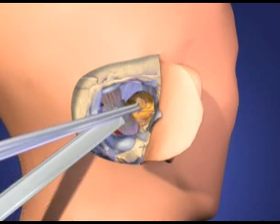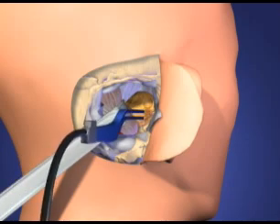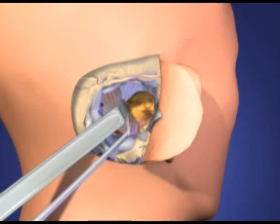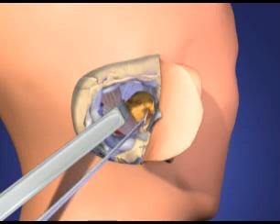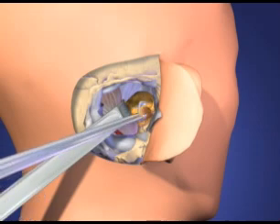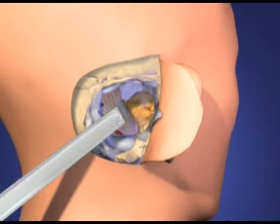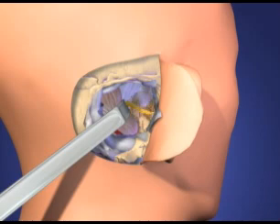Once the tumor resection is completed, the cerebellum is released and the retractor is removed. A piece of abdominal fat graft is harvested and used as a graft in order to minimize the chance of leakage of cerebrospinal fluid from the large opening in the skull.